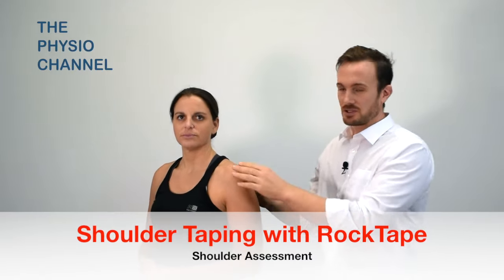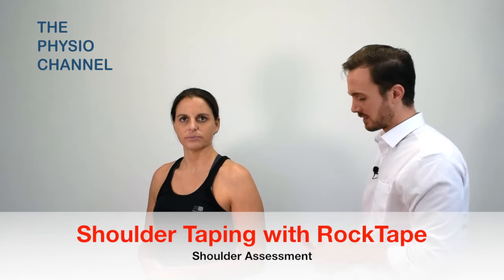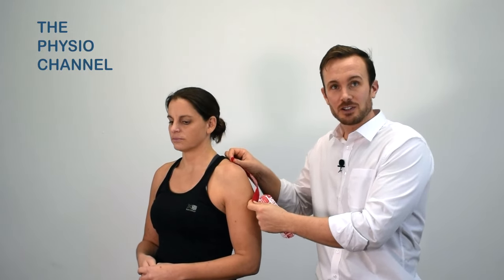In this video I'm going to show you how to tape the shoulder using kinesiology tape. I've cut two strips of rock tape here: a shorter piece that's going to wrap around the anterior glenohumeral joint, and a slightly longer piece which is going to wrap around the posterior part of the glenohumeral joint.